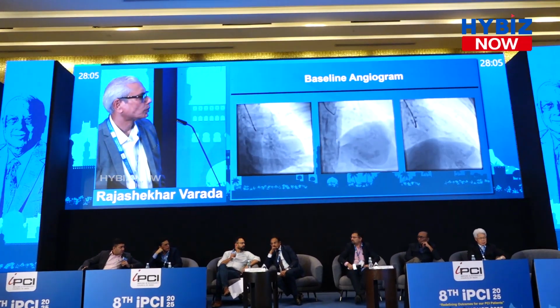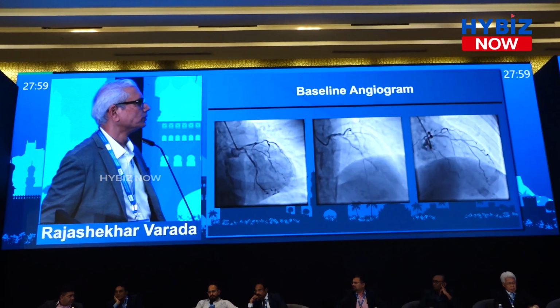Can we discuss how we will go for this case? A 66-year-old patient, diabetes with triple vessel disease, calcified. Can you go back also? Can we have an opinion, please, Dr. Arun? Yeah. So this is calcified.